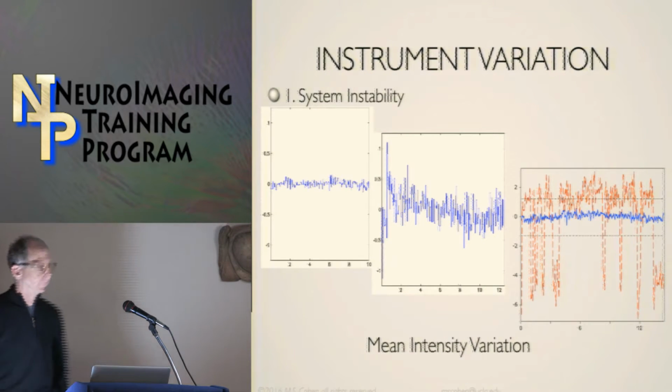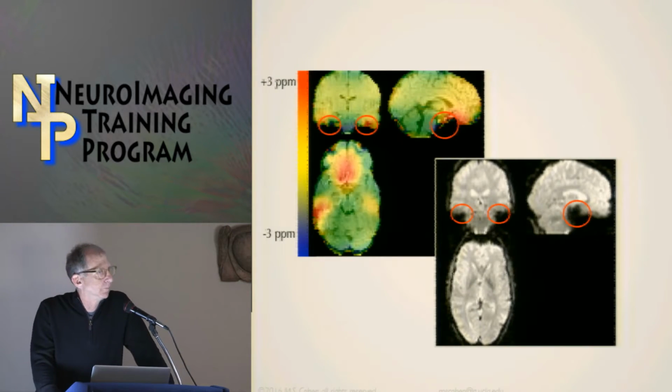So back to the slide before, we were just saying that with spectroscopy, yes, we do a lot of shimming. But with resting state, is it one possibility? Do people actually shim? I know you can shim on the whole brain, but is it a smart idea or maybe a wise idea to think about shimming on the regions that we have so much trouble getting, in addition to, say, field maps?